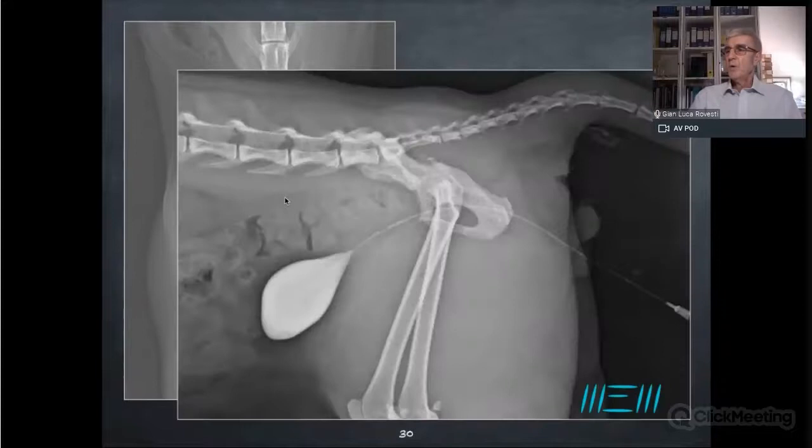We evaluated soft tissue as usual. The cat had a severe neurological injury of the left sciatic nerve, but this in my experience is not uncommon. My suggestion, of course, I have to talk about it with the owners, but my suggestion to the owner is that I would proceed with orthopedic stabilization of the pelvis, because we cannot wait 1 month in order to see how the neurological deficit will progress, because otherwise we won't be able to perform the orthopedic procedure.